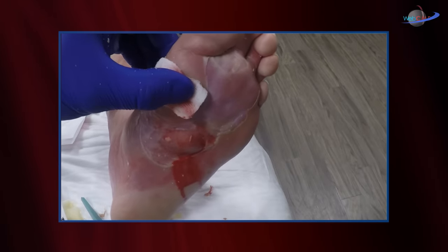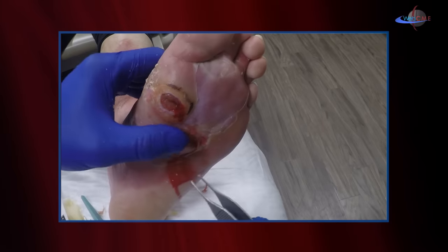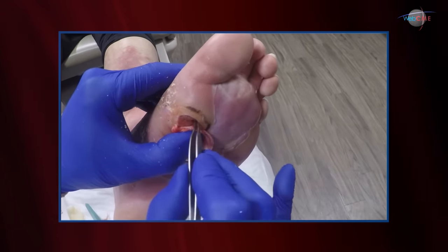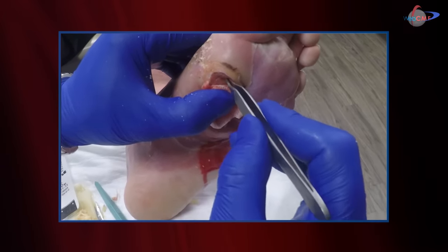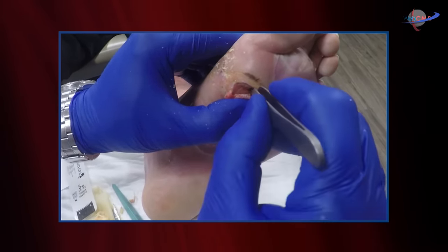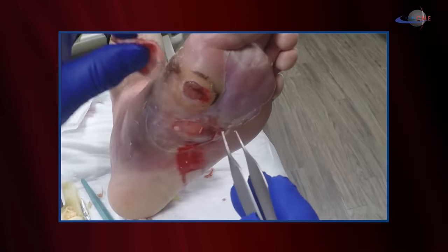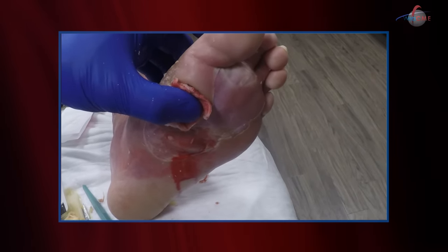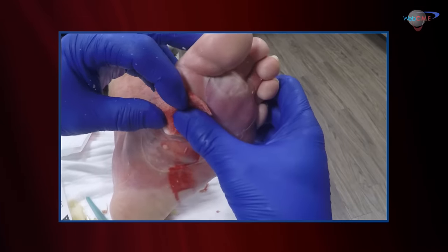One of the concerns with a foot ulcer like this, especially a septic foot, is how deep does this go. We can probe using a metallic probe. I'm using the pickups — I don't feel any bone, which is great. The patient reports that when he was in the hospital, they did some x-rays and told him the bone looked okay, which is also comforting.